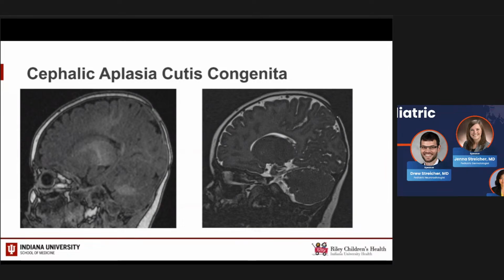Similarly, this is a sagittal T2 space sequence, a 3D, heavily T2 weighted sequence. We have a very nice look at that deficient scalp fat where the area of the skin is absent, but we do see that T2 hypointensity of the outer table that looks intact. So when protocoling an exam, a sagittal T2 space or even a CISS is often a nice sequence to add on to these patients in addition to our routine brain images, just because of the anatomic detail you get. That always is helpful to add on.